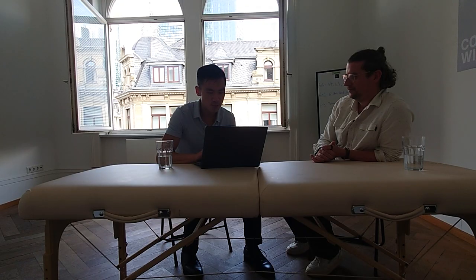Can surface EMG be used to detect abnormalities in nerve conduction? Well, it gives us an idea of the nervous system, but if you have a lower EMG, you can't say it's definitely a nerve issue in the structure. It's just a hypothesis. If you want to get an idea about the real structure of the nerve, you have to go further and make, for example, specific nerve examinations and maybe an MRI, making a structural picture.